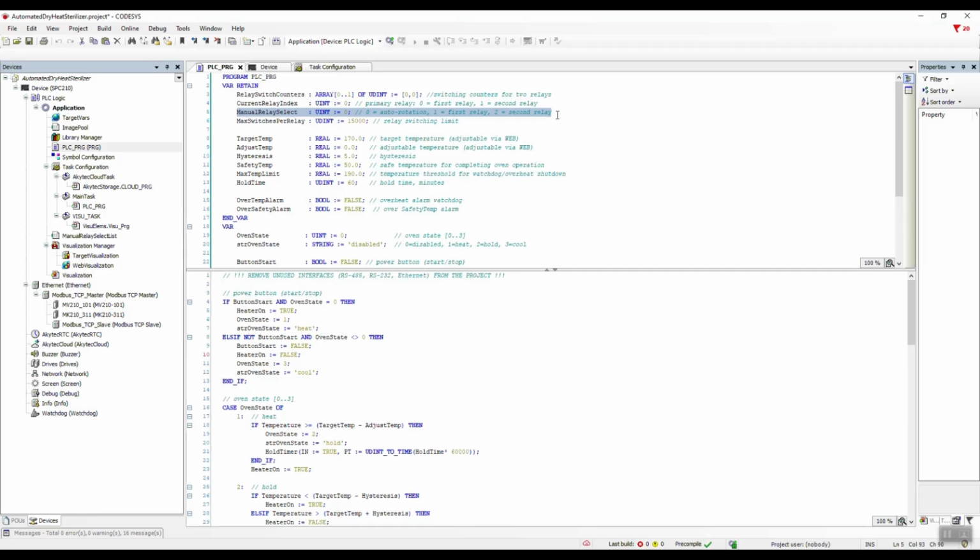The mode for selecting the main relay. 0 means auto-switching. Switching to the second relay will occur after the first relay's lifespan is exhausted. 1 means the first relay is the main one. 2 means the second relay is the main one. The maximum number of relay switchings, that is, its lifespan.